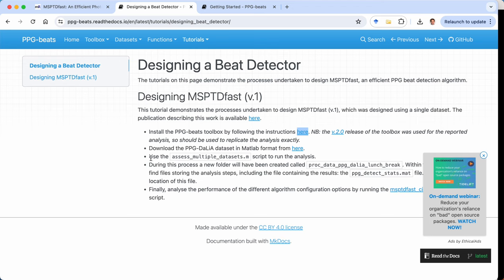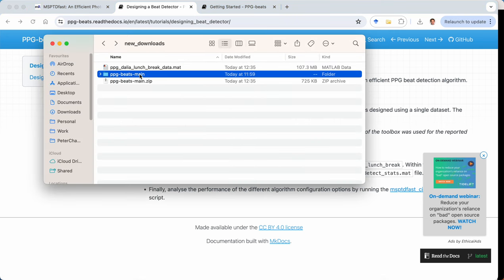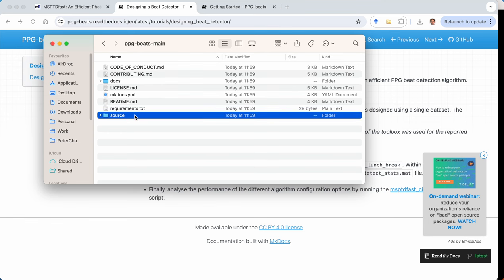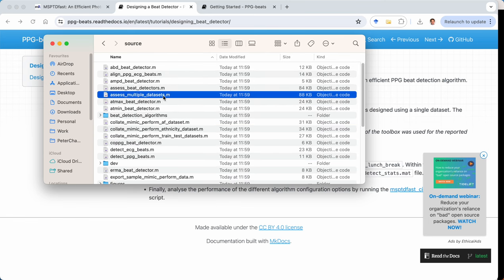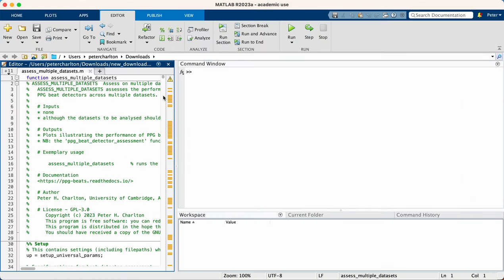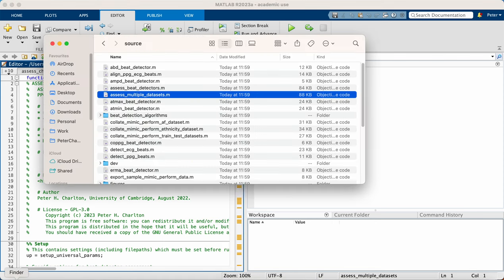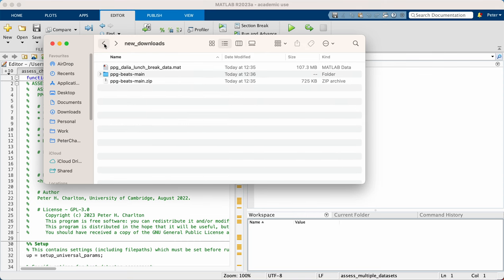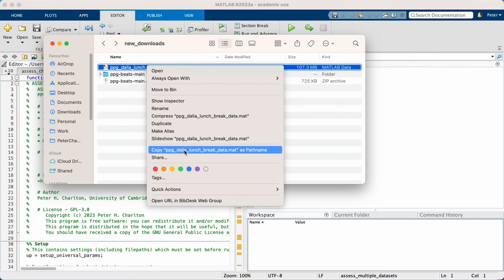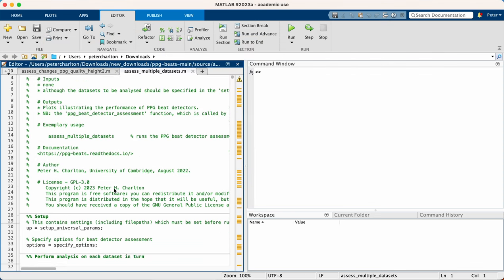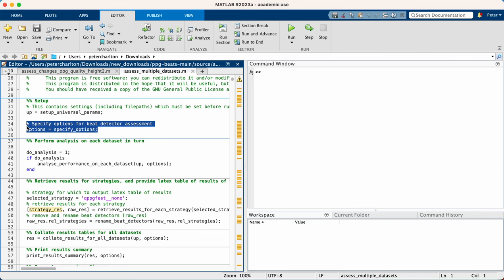And the third step then is to run the analysis using this assess multiple datasets script. So just going into the toolbox folder, the algorithms and scripts are in the source folder and the one we want is this assess multiple datasets script. So here we have it. Now there's one thing we need to do in preparation which is to specify the file path of the dataset. So we'll copy the path of that file and then we'll come to the specify options function.